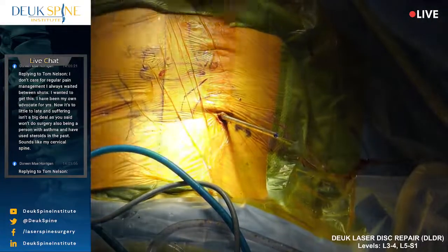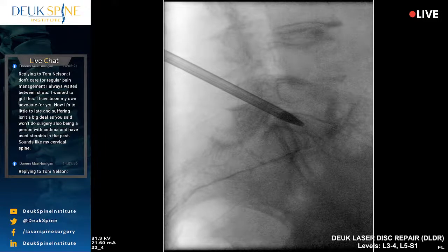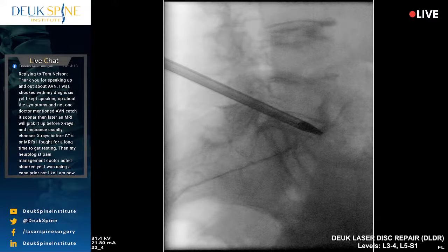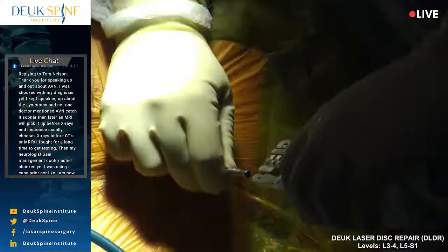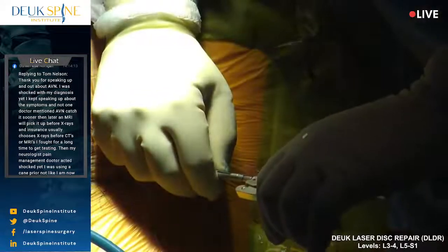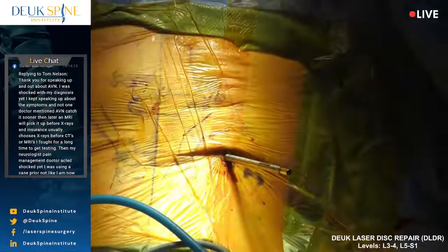All right, so this is a tough one. I don't want to advance this dilator anymore, so let me have the dilator grabber and pull it back just a little bit. That's better. He's fine.